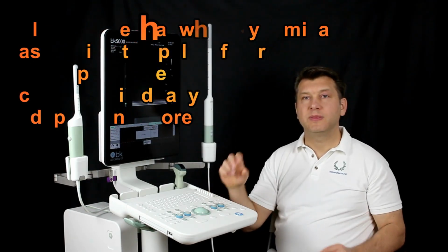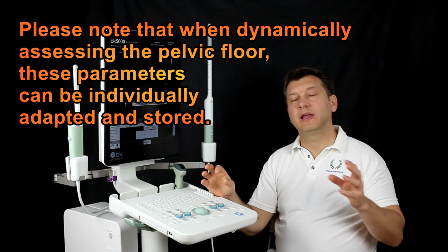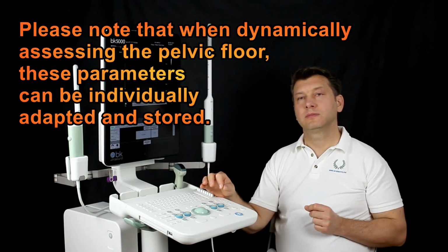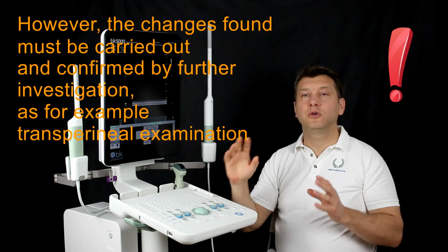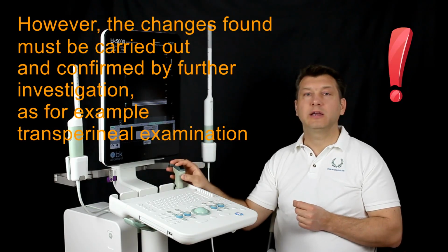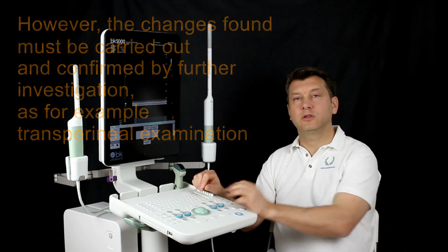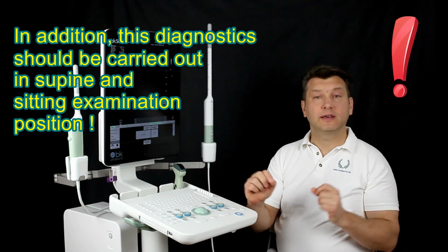Please note that when dynamically assessing the pelvic floor, these parameters can be individually adapted and stored. However, the changes found must be confirmed by further investigation, as for example a transperineal examination. In addition, this diagnostic should be carried out in both supine and sitting examination positions.